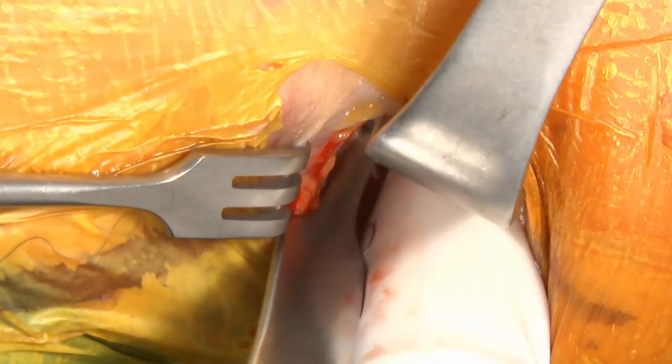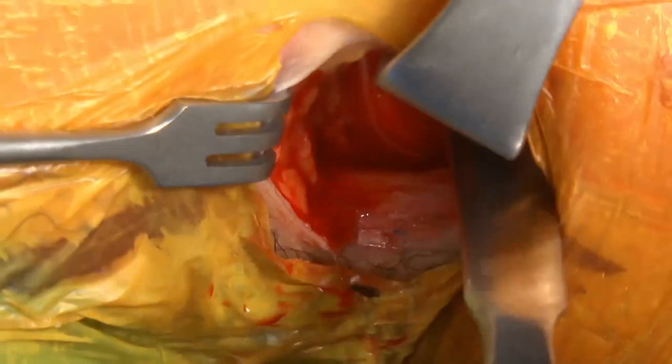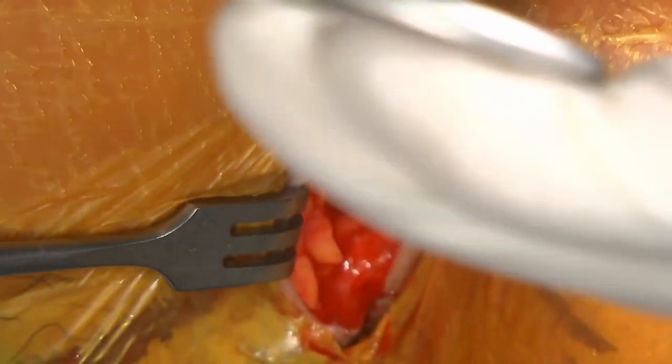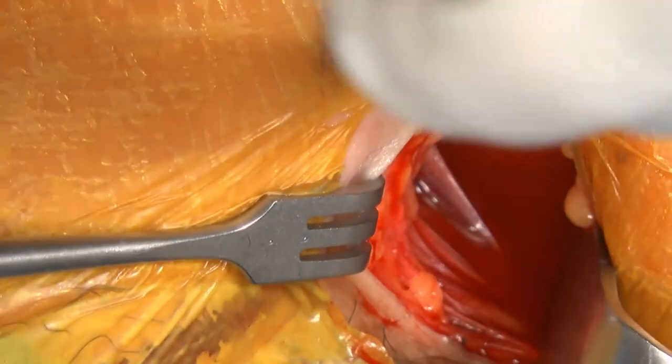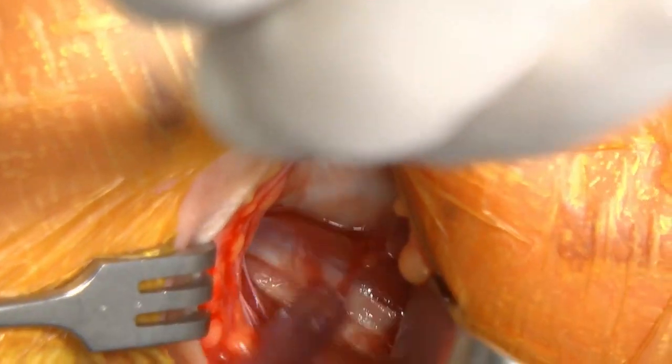So we're going to put a Holman here, and we're just going to go through the pec. We don't have to do this, but this will give a much better view of what we're working on. We just poke through the pec like that, and over the humerus, we can take this out now and hold this up. And then we open this up here, and we'll get our water out, which is coming from our arthroscopic procedure.